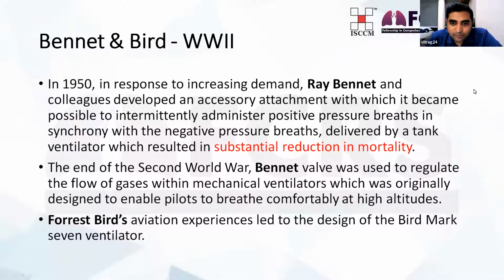At the end of the Second World War, the Bennett valve was used to regulate the flow of gas within a mechanical ventilator, which was originally designed to enable pilots to breathe comfortably at high altitude. Forrest Bird was also an aviation specialist, and his aviation experience led to the design of the Bird Mark 7 ventilator.